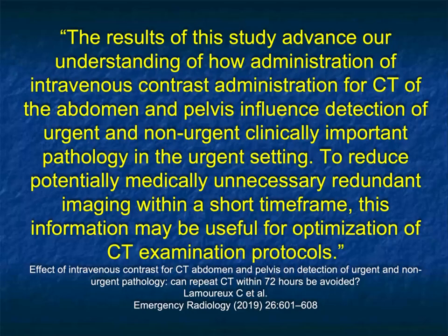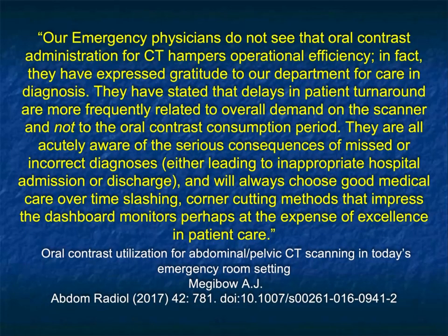Our protocol is give IV contrast. There are select reasons you can't. Perhaps there's a severe allergy. Perhaps the patient's in renal failure, or you're looking for a stone. Otherwise, you've got to give IV contrast.